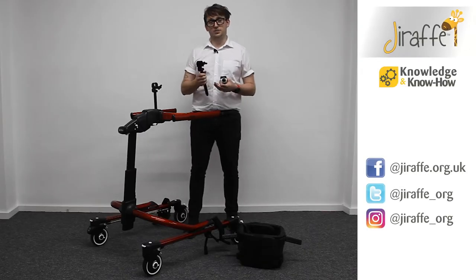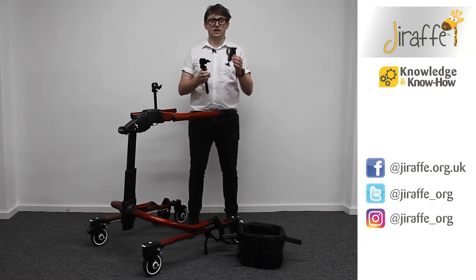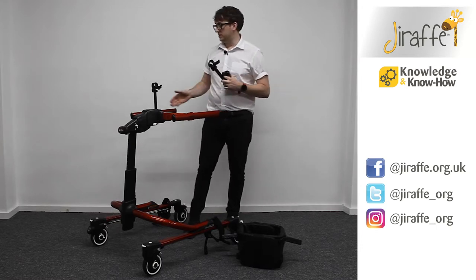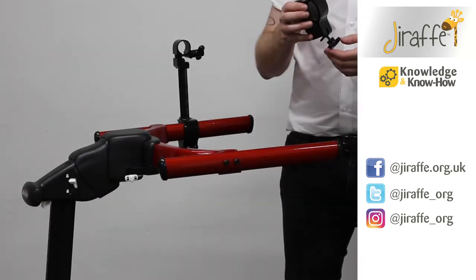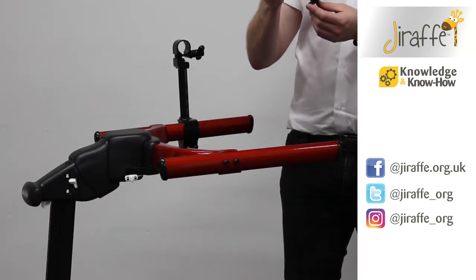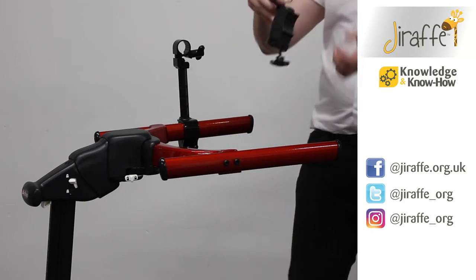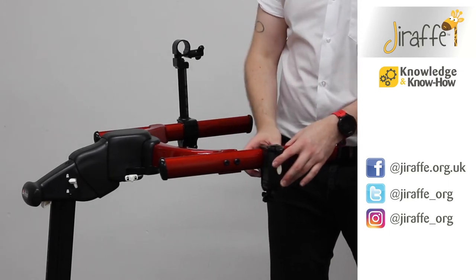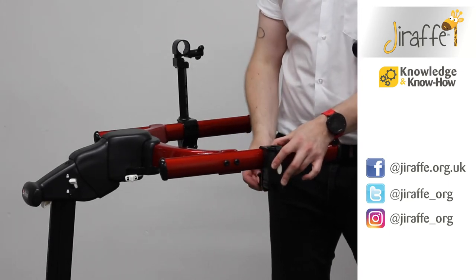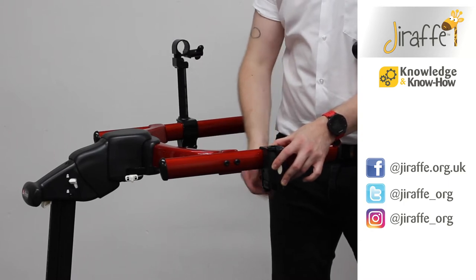We're now going to take a look at the chest prompt on the Dynamic Pacer. The first thing that we need to do is fit the clamp and the fitting. As you can see on the right-hand side here we've already got that in place. Make sure that the wing knob is loose, then lift up the section, place it on the frame, and close the clamp. We're then going to tighten that wing knob so it's in place.